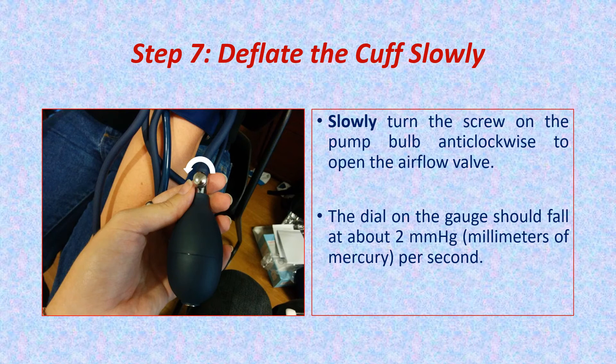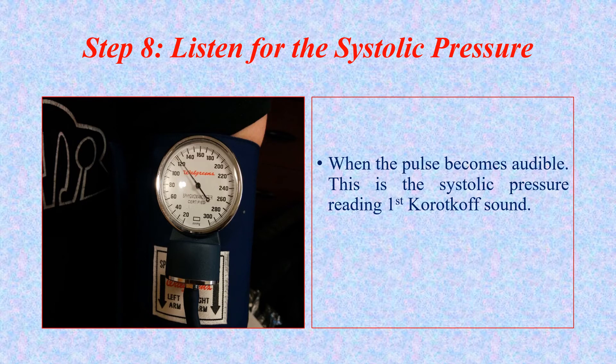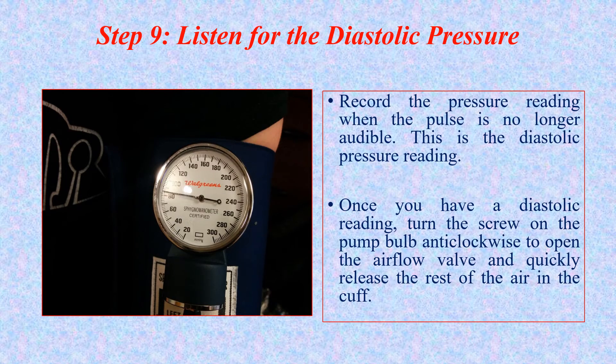Continue deflating until you hear the first sound. When the pulse becomes audible, this is the first Korotkoff sound and this is the systolic blood pressure reading. Then continue gradual deflation until no pulsation is heard — the sounds begin to disappear completely. This is the fifth Korotkoff sound and represents the diastolic blood pressure reading. Once you have the diastolic reading, turn the screw anti-clockwise to open the airflow valve and quickly release the rest of the air in the cuff.